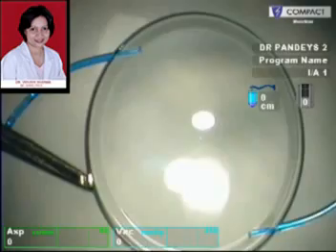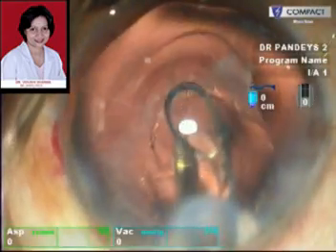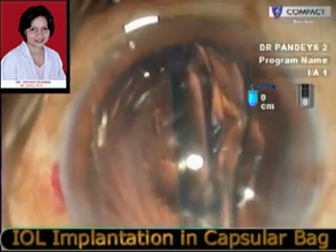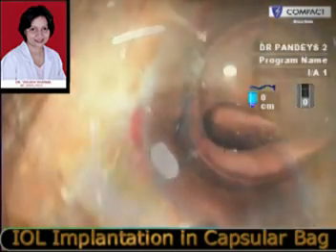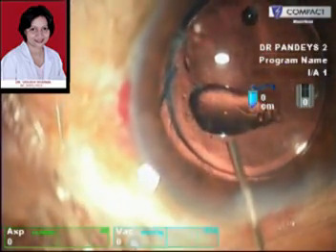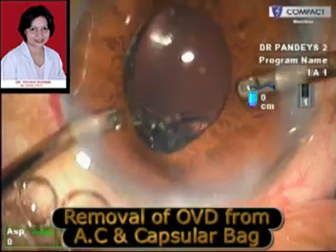Here a 3-piece Sensar IOL from Abbott Medical Optics is being injected. This IOL is implanted in the capsular bag. A single piece IOL may be preferable for some surgeons. However, whatever IOL we use, it should be implanted in a slow, careful manner with slow and controlled unfolding. And of course, needless to say, silicone IOLs are completely avoided, and an acrylic IOL is preferable in these cases.